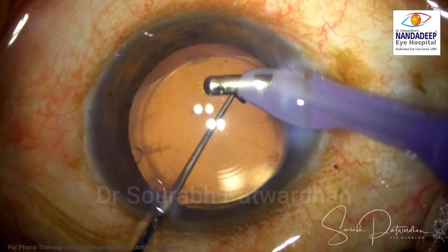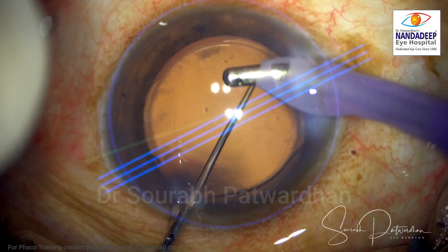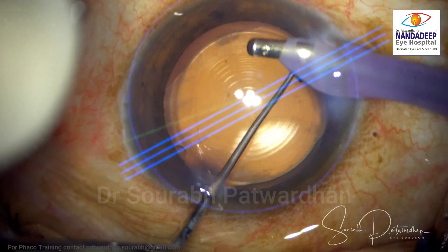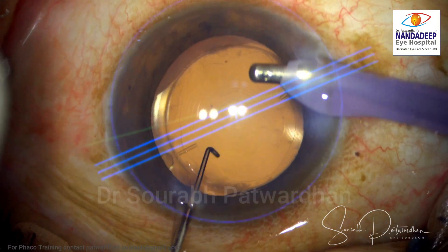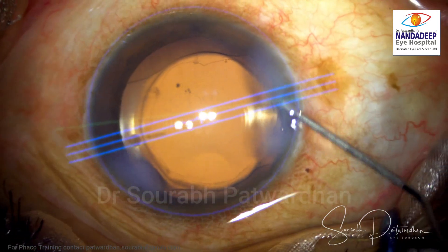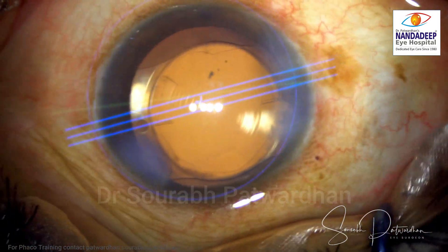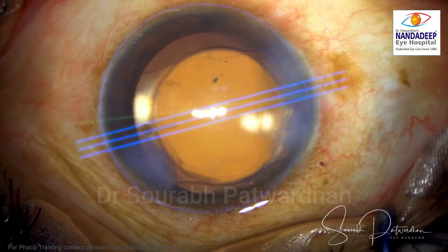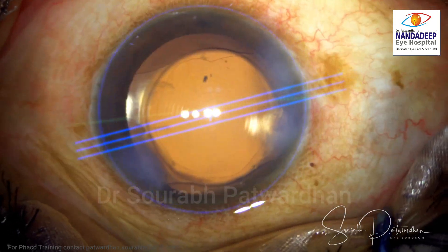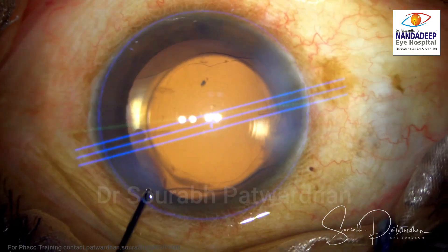It may also result in myopic refractive error. The plate haptics are right on the target — a little nudging is what is needed to bring it on the axis of placement. This is the Z-align system of the Callisto, which is helping me to align the IOL in the proper position — quite accurate and hassle-free as compared to manual marking.